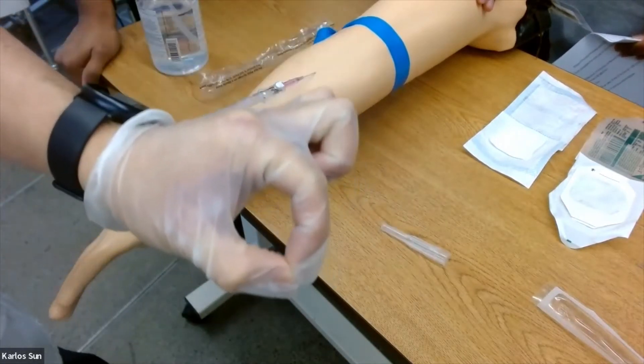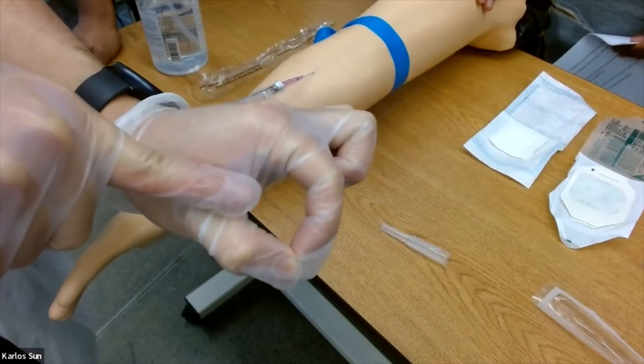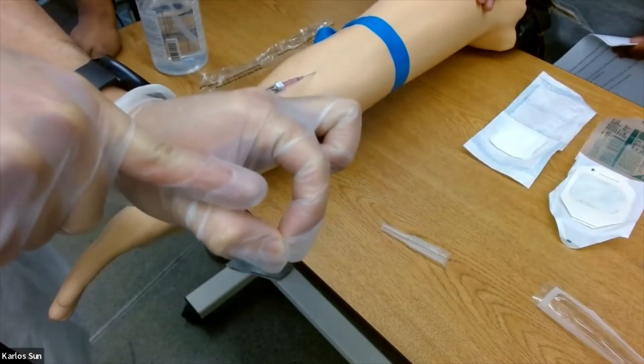Once you see blood flashback or the barrel fills up, advance the needle by another one to two millimeters to ensure the needle is in the lumen of the vein.